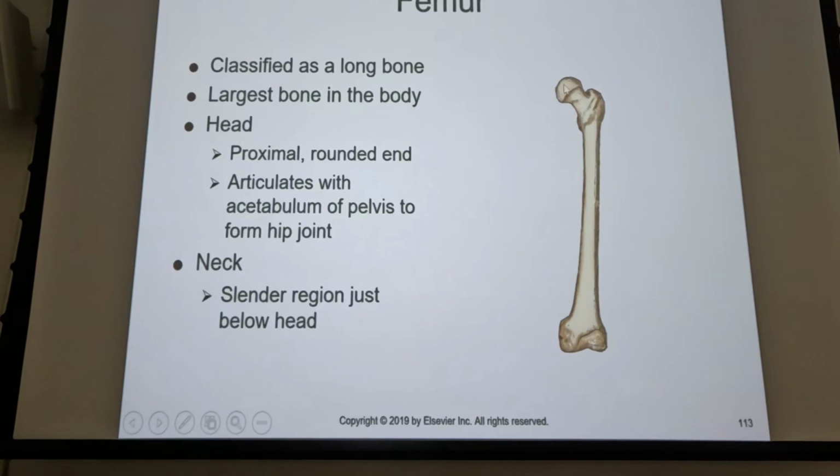Most common hip fracture is probably going to be your intertrochanteric, in which case they're going to put one great big fat screw all the way up into the head of the femur, and then they're going to put a plate down the lateral side of the femur with screws going across.